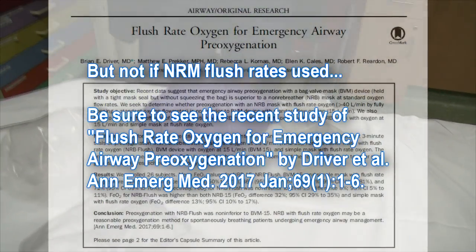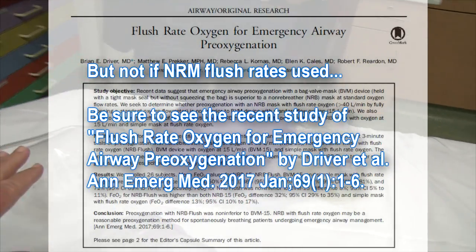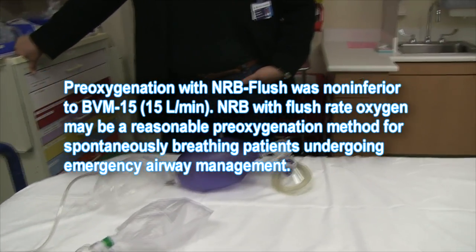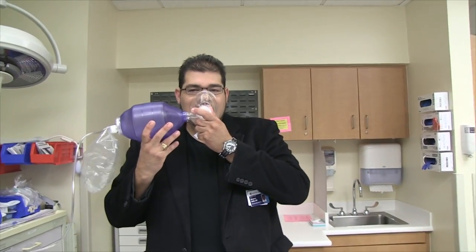But I want to go back to this. I want you now to breathe. This is at 15 liters a minute. I'm going to crank this up, and I want to see if you can actually empty the bag. Let's imagine you're air hungry, breathing 30, 40 times a minute, and we're trying to preoxygenate you as we're getting ready to intubate you. Let's see if you can overwhelm this bag. Okay, start breathing, hyperventilate.